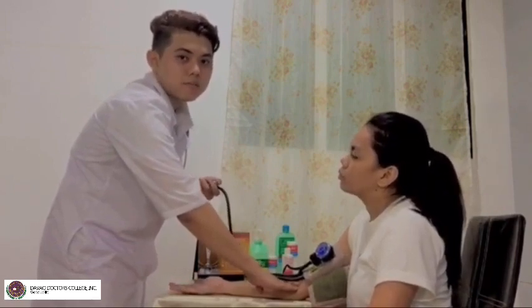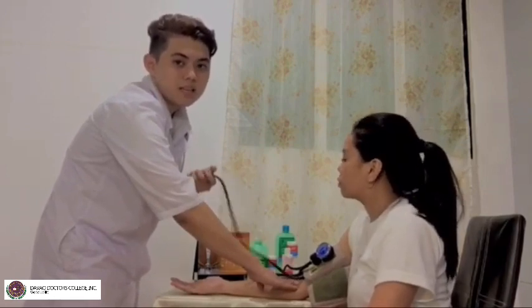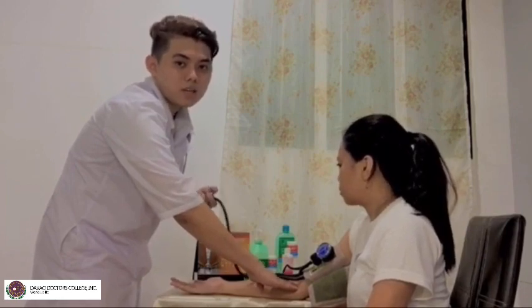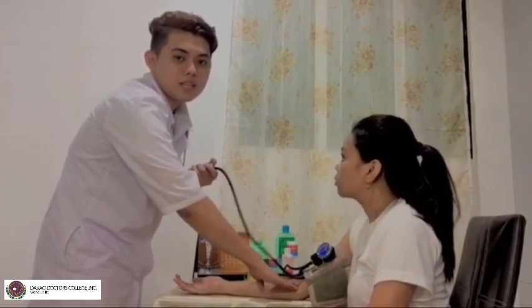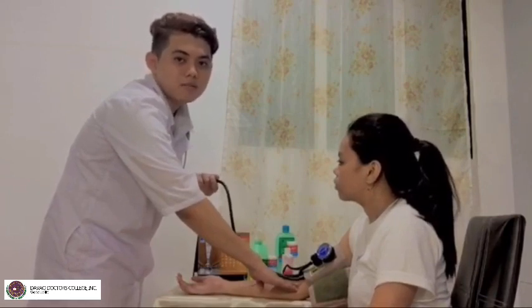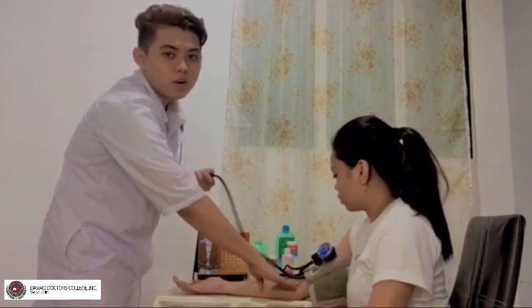Note the pressure on the sphygmomanometer at which the pulse is no longer felt. This gives us an estimate of the systolic pressure. Release the pressure completely in the cuff, and wait 1 to 2 minutes before making further assessments. It is because a waiting period gives the blood trapped in the veins time to be released. Otherwise, false high systolic readings will occur.